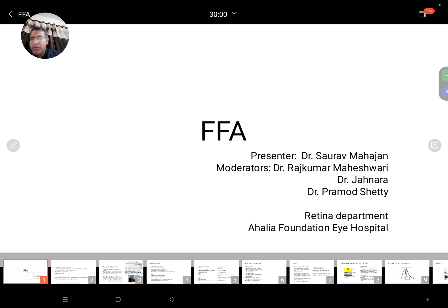Last time we had read about the basics of FFA. So today we will be going over the main examples in some of the main diseases of FFA.